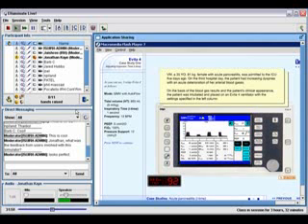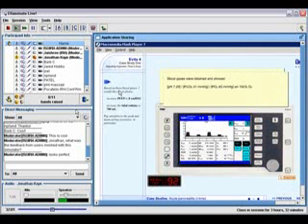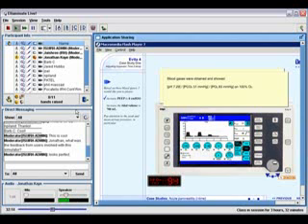They follow along, and then they're asked by the doctor to increase the PEEP to 8 centimeters and increase the tidal volume to 700 milliliters. Based on their introduction, they have to know how to operate the device to increase the tidal volume and the PEEP, and there's a lot of flexibility in the order. Okay, good. I'm glad to hear someone mention it was looking fine.